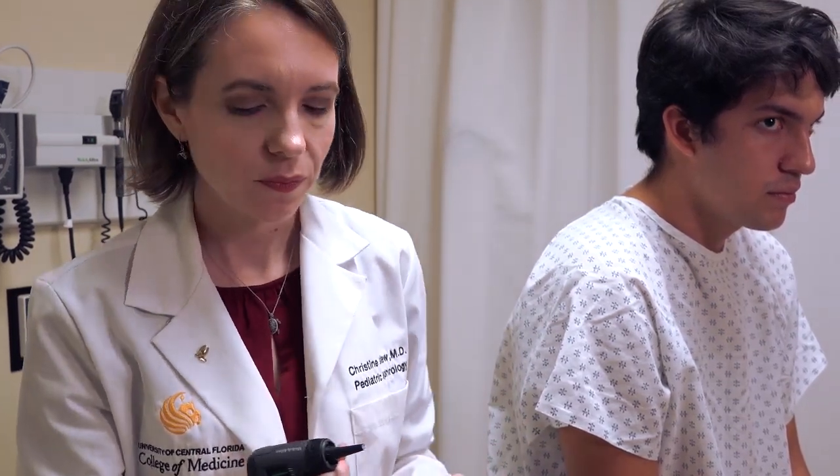The ear canal's skin is very thin and easily friable. In children specifically, they won't necessarily hold still for you. Most adults will stay with you, and even if startled, won't jerk too badly. But younger patients, or patients with a disability that doesn't allow them to remain calm, could be a problem. So make sure you always use some kind of anchor.